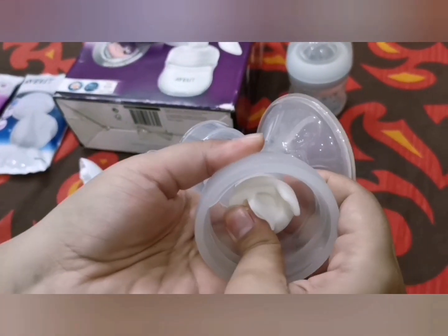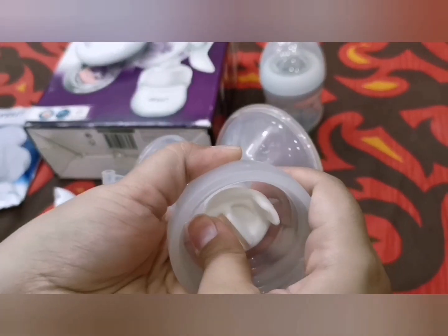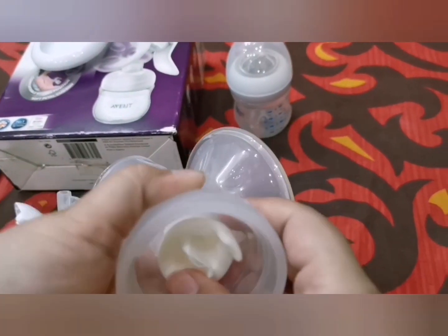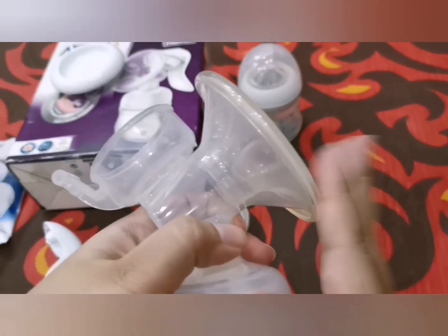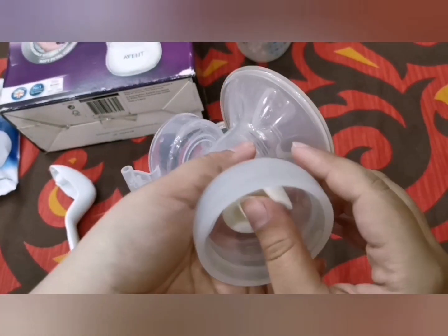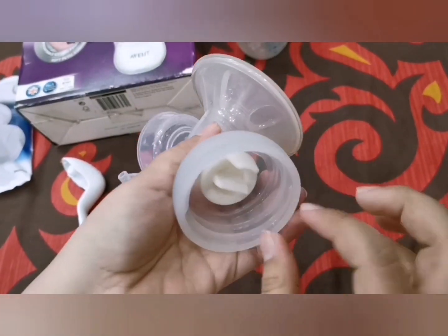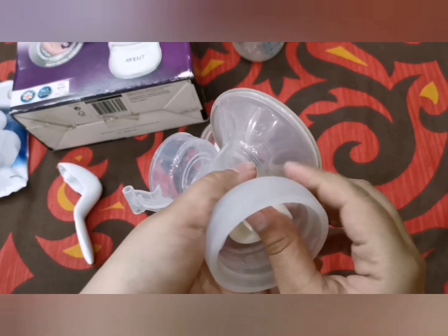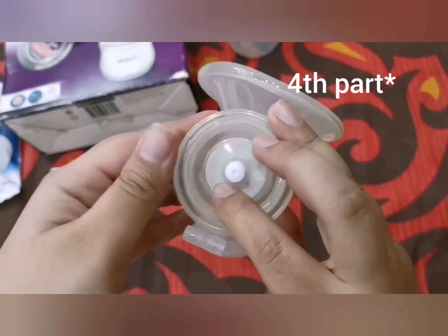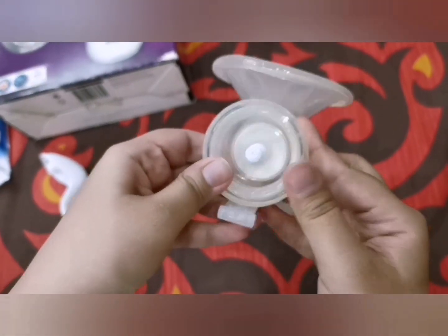The tip is to push it as far as possible to fix it as tightly as possible. If it is loose, it will not help to express milk properly and it will take a lot of time — and nobody wants that. So just try to go as far as possible. The third part fits on very smoothly and gently.